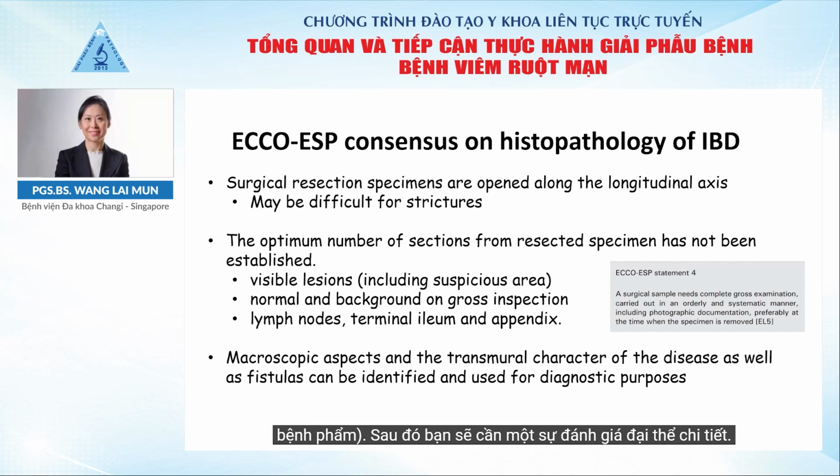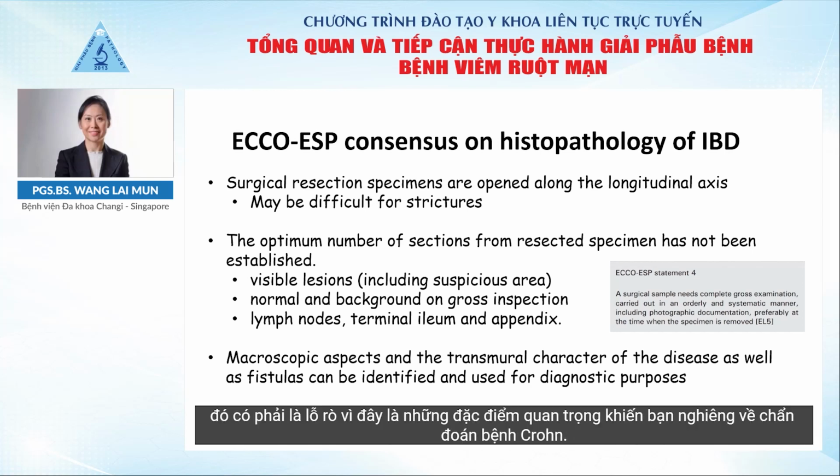Then you must give a good detailed macroscopic examination, such as whether there's transmural involvement and whether there's fistula, because these are important features that make you lean towards the diagnosis of Crohn's.